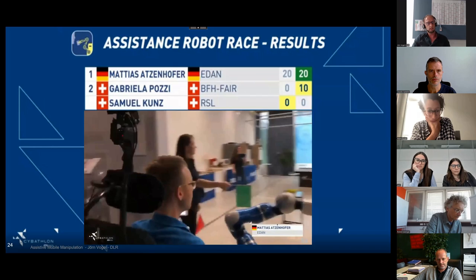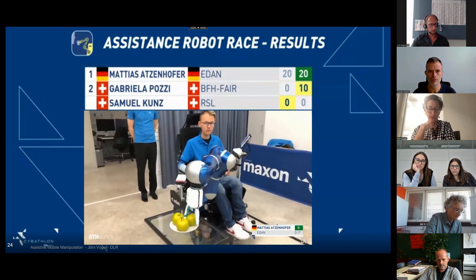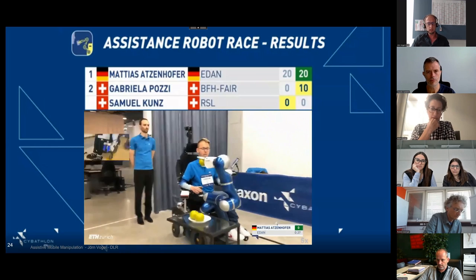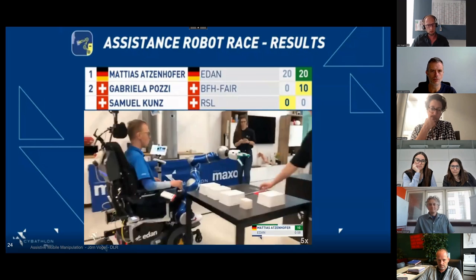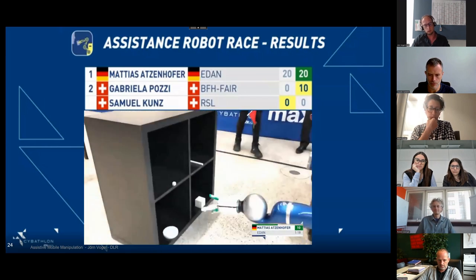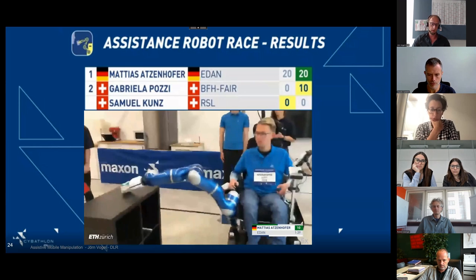Let's rather jump forward to our first participants in the Cybathlon challenges in 2023, where the first task was to pick an apple. And as you can see here, basically our pilot, Matthias, is using a 3D joystick. And she just has to drive the hand close to the apple, and all the orientation and the grasping is coming from the shared control support.